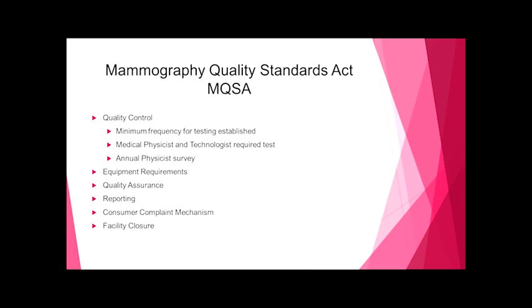Then, of course, the reporting of results was a big deal 15 years ago when they came to us and said, okay, you're going to have to communicate results. Not only that, they gave us all these parameters for who, what, how, and when. We met all of those, but it was one of those things where, oh my gosh, there's a lot of criteria here that have to be met.